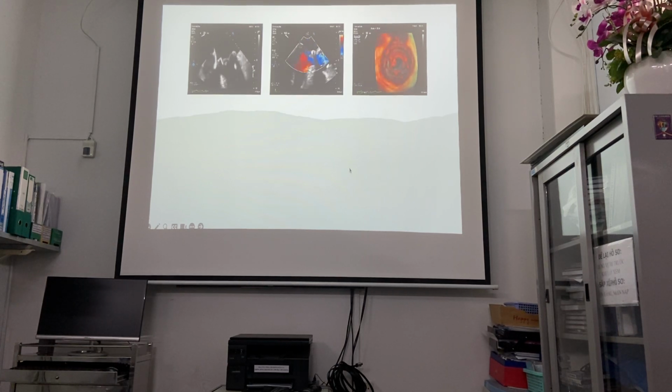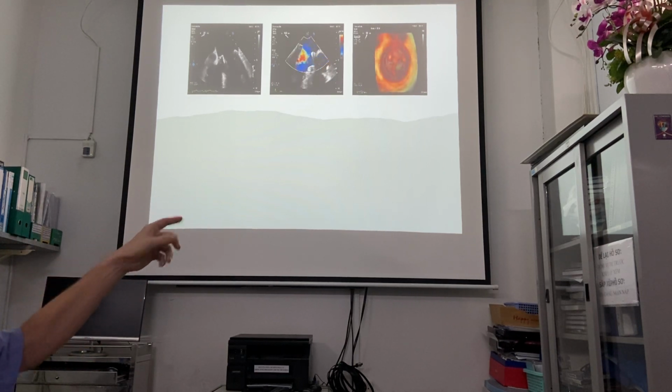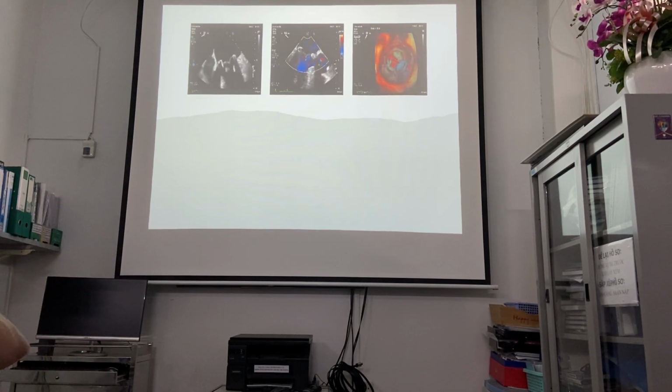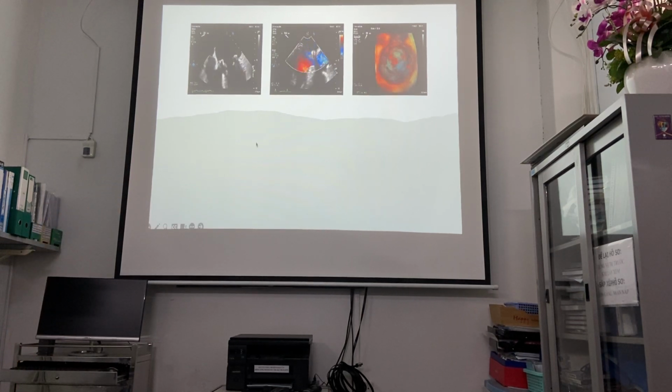So he has a bioprosthesis for the endocarditis. He changed his valve, and this is the new valve. You see the annulus of the bioprosthesis here, and you see the bioprosthesis functioning. But there is something definitely wrong now.